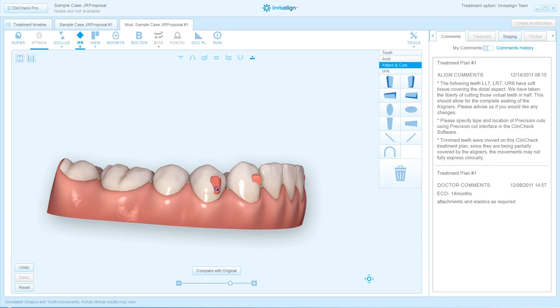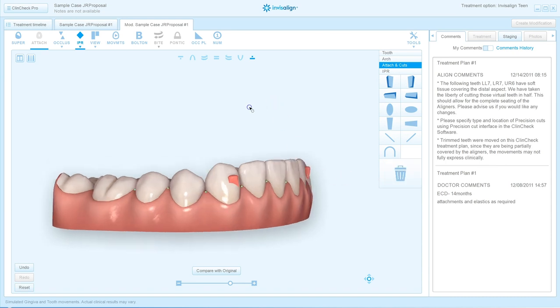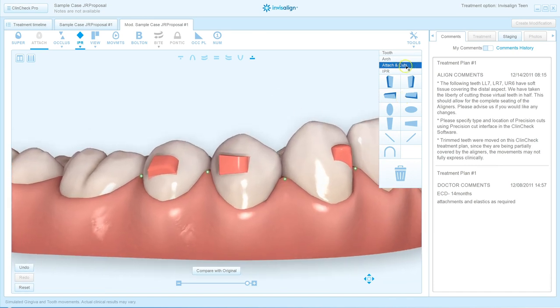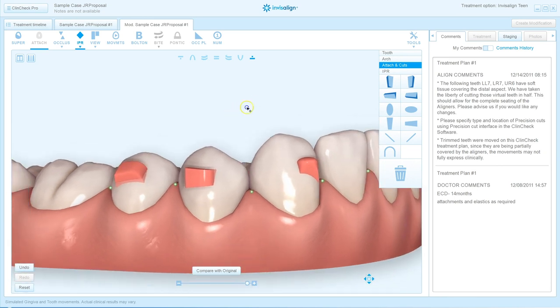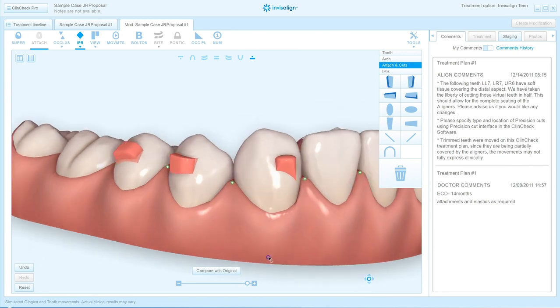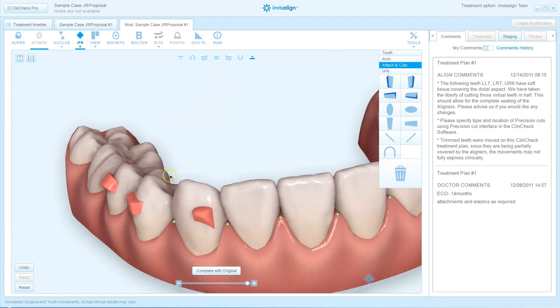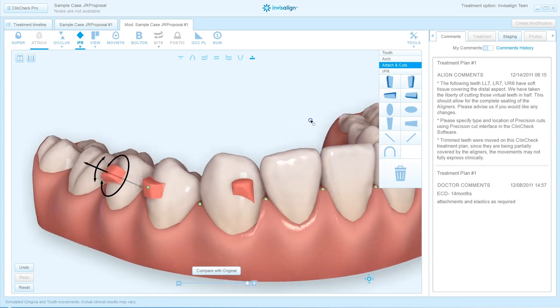We have two choices in our attachments that are horizontally retentive and still forgiving on the lower bicuspids. One is the horizontal bevel to the occlusal attachment, and one is the horizontal bevel to the gingival attachment. The horizontal bevel to the occlusal attachment — I put it on the tooth just the way it came off of that palette, our little painting palette. I position the attachment at the right height of the tooth and leave it at the very angle that it came onto the tooth. It's forgiving, and it has about a 1.25 millimeter surface area of retention that, working with the lingual wall of the tooth, will give us a grip on that tooth for curve of Spee leveling.